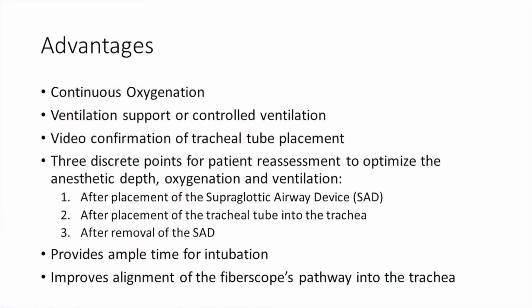Perfect. Thank you. The advantages of this combination technique are numerous and include the ability to provide continuous oxygenation, ventilation support or controlled ventilation, video confirmation of the tracheal tube placement, as well as three discrete points for patient reassessment to optimize the anesthetic depth, oxygenation, and ventilation of the patient. First, after placement of the supraglottic airway device. Second, after placement of the tracheal tube into the trachea. And last, after removal of the device over the tracheal tube.